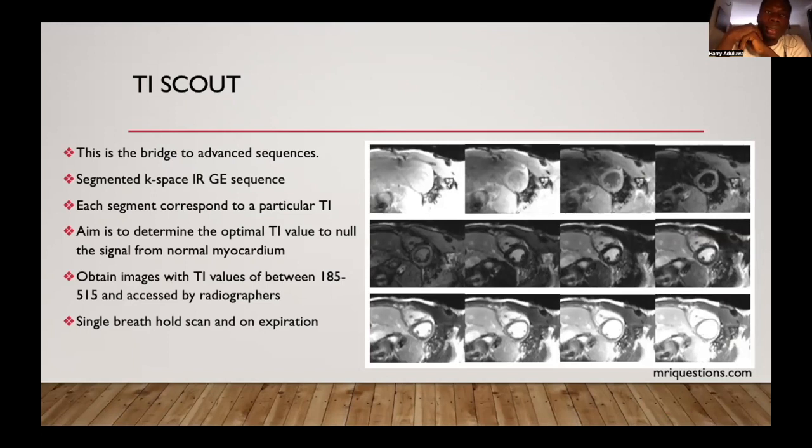I should be done in the next 3 minutes. I'd like to state something to us. One of the mistakes I made when I started scanning is that I didn't really understand what TI Scout means and its importance. So I would just figure out anything and throw it to the cardiologist, who has been so gracious and just taking all my sheets. Because I'm so busy, I didn't have the time to read about it. But at least for now, I will give us the basic knowledge for TI Scout.